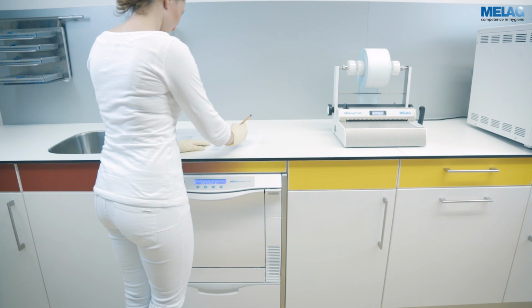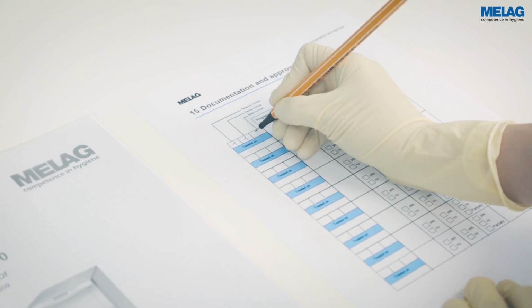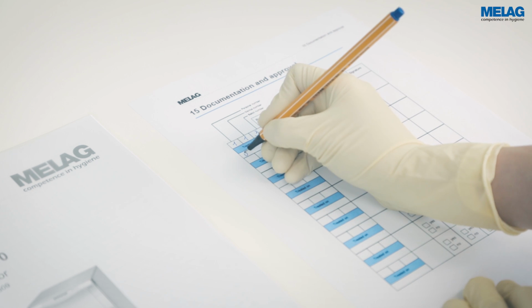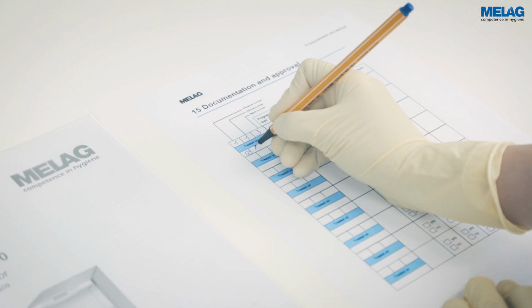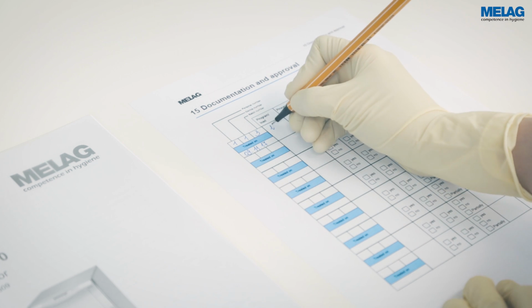After completing a program, record your personnel number, a batch number beginning with 1 every day, the approval date, and the program name.